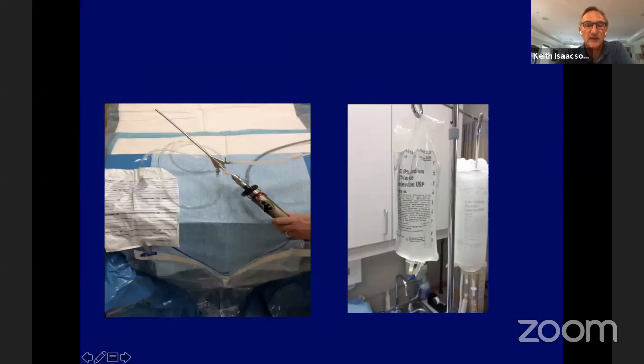Again, for fluid management, that particular system comes with inflow tubing and outflow tubing. So you get your inflow tubing, outflow tubing, and collection system all for around $20, and it's now available through Karl Storz. So again, most of the time you'll do fine depending on the system that you use, but with this particular scope, you'll get adequate distension either with just a gravity hanging bag or using a pressure bag, and you're only going to use saline in the office. There's no reason to use any monopolar electricity, and there's no reason to ever use electrolyte-free media.